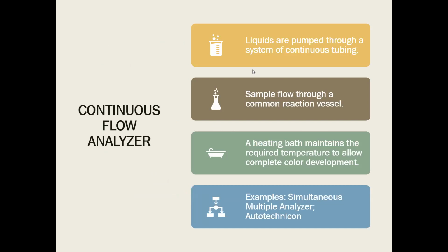So when we said continuous analyzer, it requires liquid. No, liquids are being pumped through a system of a continuous tubing. Take note of this: continuous tubing, continuous flow analyzer. Fluids are pumped through a system of continuous tubing. Next, another thing that I want you to take note about continuous flow analyzer is that sample flows through a common reaction vessel. Okay? Common reaction vessel.